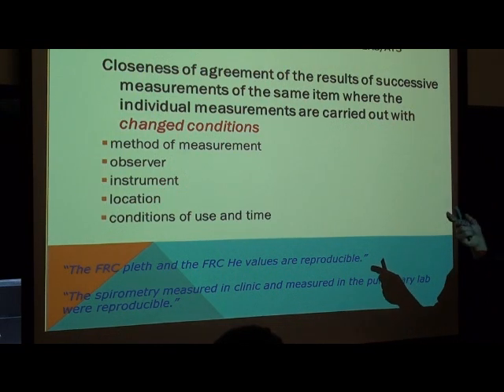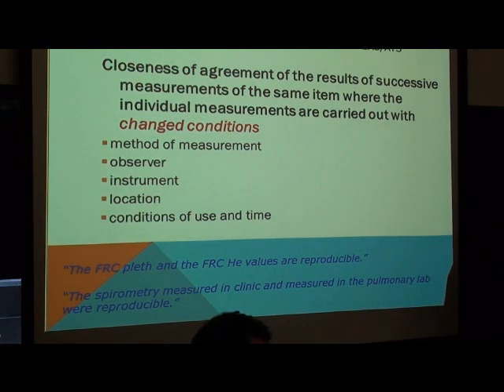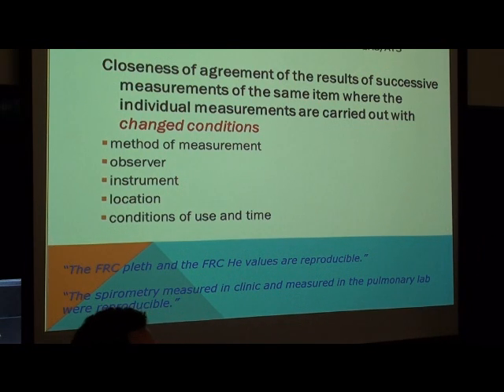And from our perspective, we want to see reproducible results in the biological control arena. That's kind of our way of saying that, yeah, these are all calibrated. We know all the instruments are calibrated, but everybody in this room has probably seen instances where a device that was calibrated yielded slightly different or sometimes grossly different results than what was expected. That's the reason for our biocontrol program. We'll talk more about that in just a little bit.